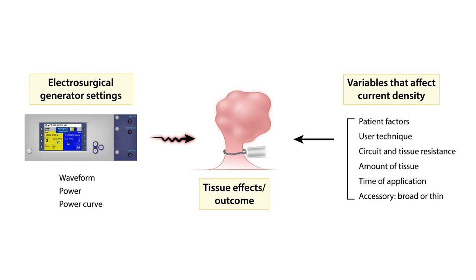To have a tissue effect, what ultimately determines the effect is dependent on multiple issues.